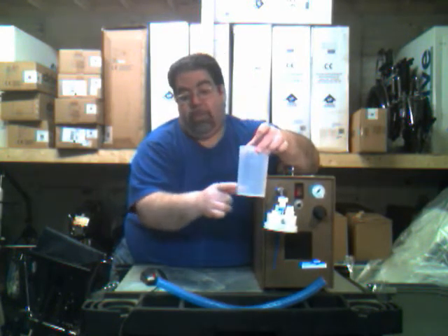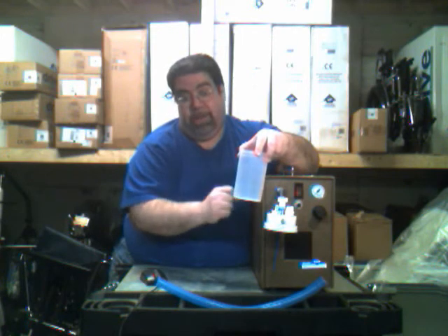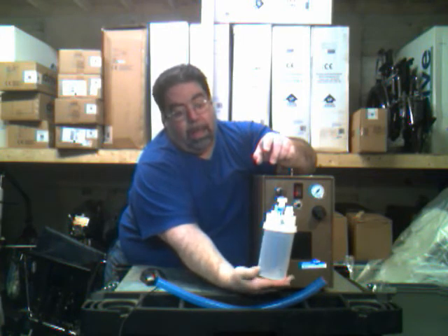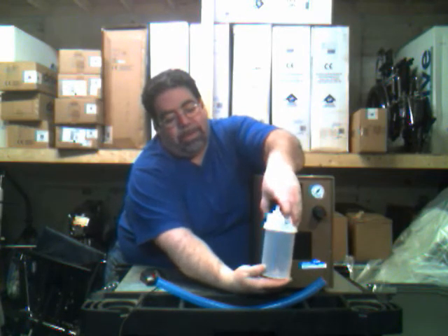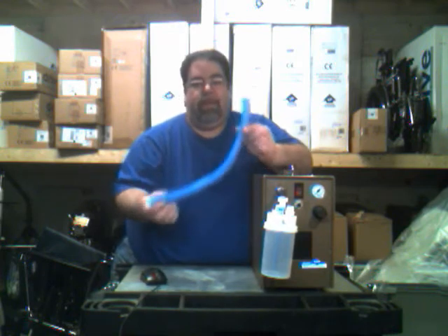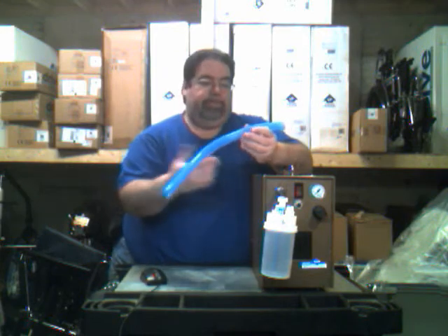Distilled water — or sterile water, depending on what your facility uses — is placed in the jar. There is a low level and a maximum level, indicated by two lines on the jar. Low is at the bottom and full is at the top. Once the water is in, place the bottle on the adapter and turn it until it's nice and tight. The only thing left to set up for the patient is to put on the corrugated tubing. For this demonstration I've used a small piece since there's no need to waste it.